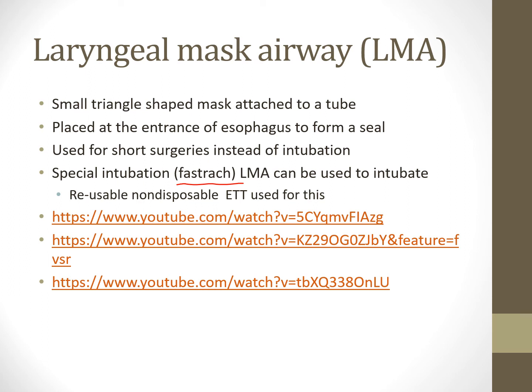So make sure that you know your hospital's policy and procedure on these, right, before you start using them. So these are things during orientation and during clinical rotation. Hey, these are good to ask. Hey, what's your policy on this? Or do you guys use an LMA? Or do you guys use king tubes? Or do you have all of the above, right? I know we had like an all of the above type situation. So make sure you know how to use them. Make sure you know that policy and procedure that they have for them as well.